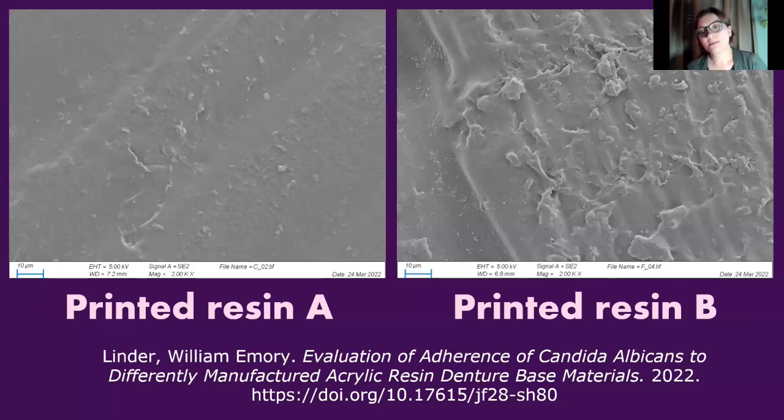use. And same when you look at these underneath a scanning electron microscope. So the two slides, right and left, look pretty different as far as the surface topography goes. These are just two printed resins that were printed on two different printers, and they were set to the same resolution. So they should have been pretty similar, but just the variation in the printer technology and the variation in the resin itself changed that surface texture.